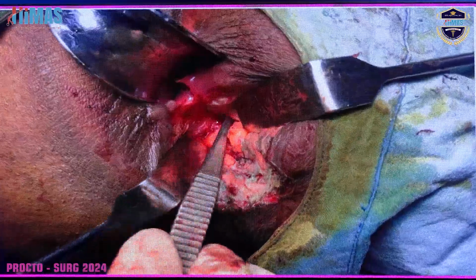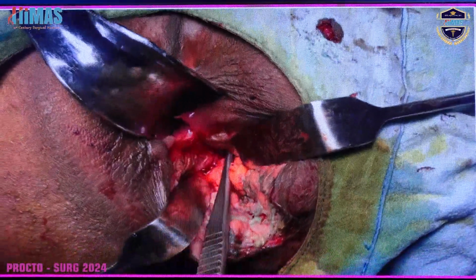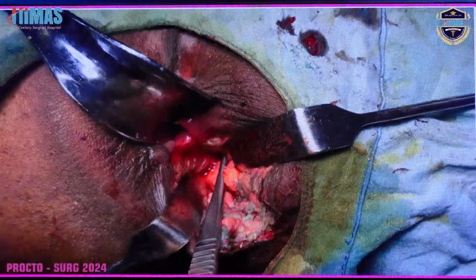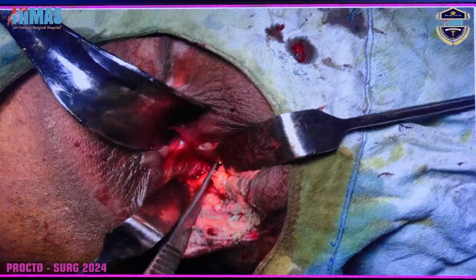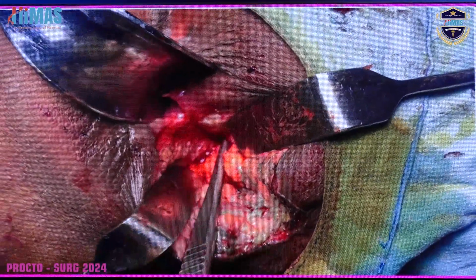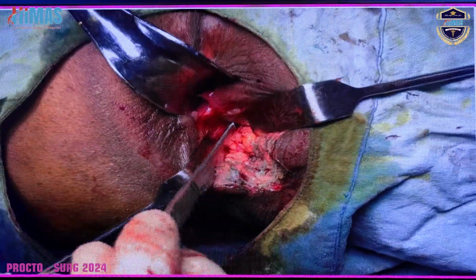We have removed the tract, and now we are going inside. I'm more of a radical surgeon. I prefer removing all the tract. So this is the tract we have removed. Now I am curetting this portion of the supralevator extension. This is the high transsphincteric fistula with the supralevator extension. So after curettage, the thing is we can't see inside. We can only curette it. So at this time, we can introduce the VAAFT scope inside and just see what is going on inside.